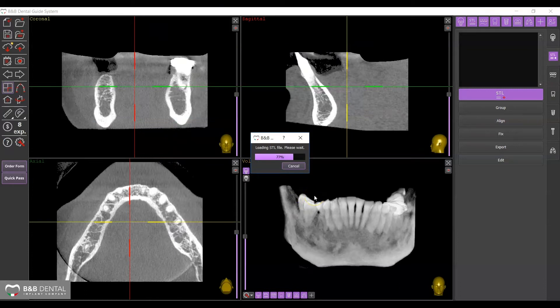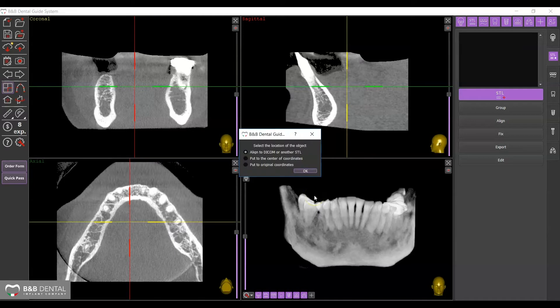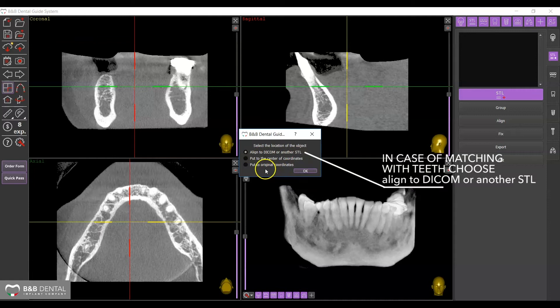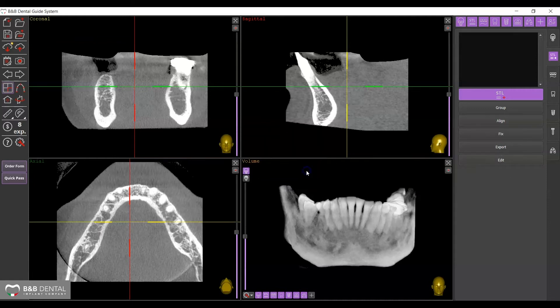In cases where the matching between the DICOM and the STL files occurs through the residual teeth, select Align to DICOM or another STL in the window that appears and proceed.